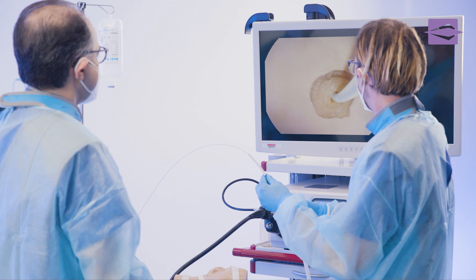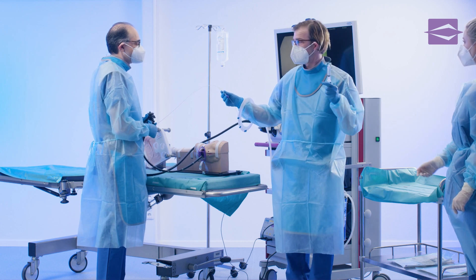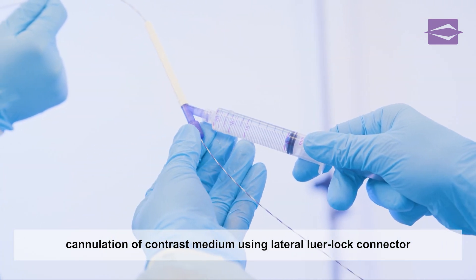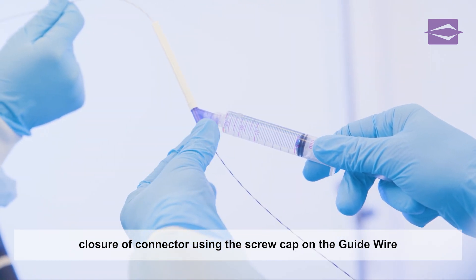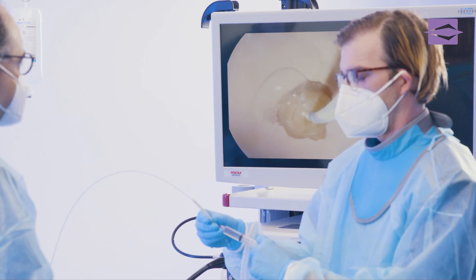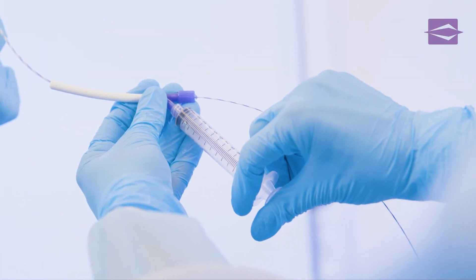Cannulation is initiated with a prepared syringe filled with contrast medium. The assistant places the syringe on the provided lure lock connector and locks it in place. To prevent unintentional leakage of contrast medium from the guide wire access, the screw cap must be closed over the guide wire. The cannulation of the bile duct is done with even pressure on the plunger of the syringe. The bile duct and the guide wire in place can now be clearly seen radiologically on the x-ray monitor.